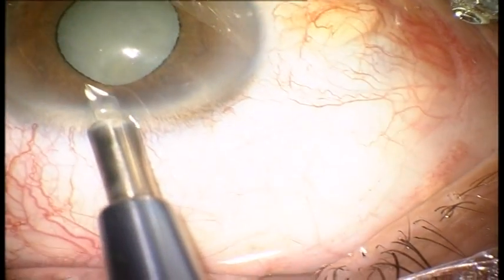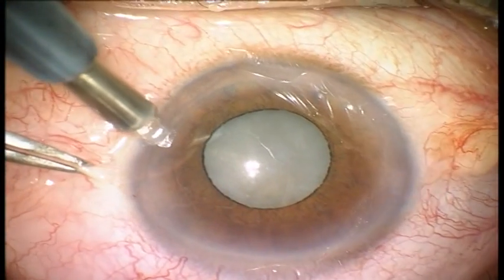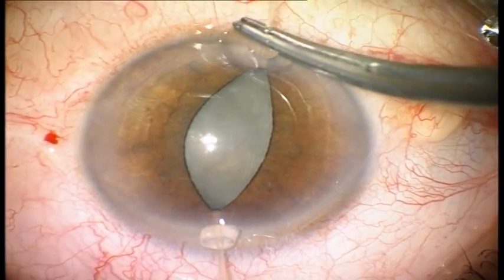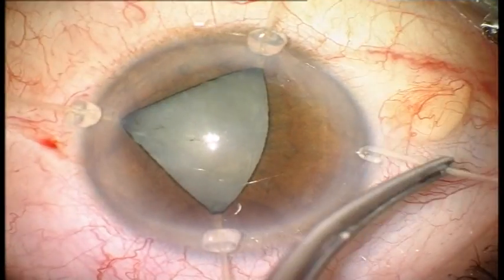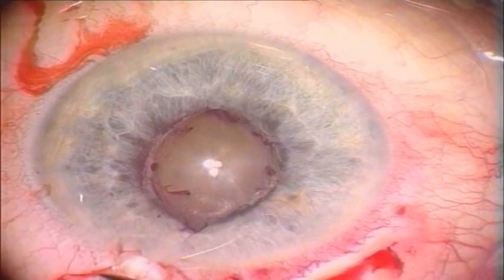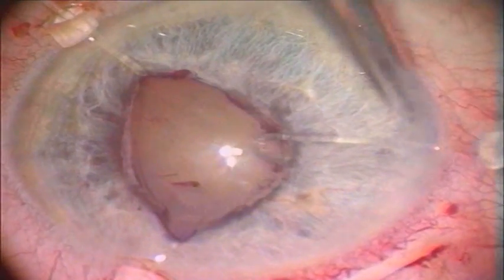Failure of the above-mentioned methods led us to the use of Dijuan hooks. These hooks of soft and flexible nylon are introduced after four symmetrical incisions. We catch the pupillary margin and then its retraction is carefully forced toward the iris periphery, where it is fixated with the help of the hook's adjusting silicone sleeve. Some surgeons prefer to use the hooks in a triangular pattern to reduce the number of incisions and subsequent inflammatory response. Occasionally, slight bleeding can be observed at the stretching site.